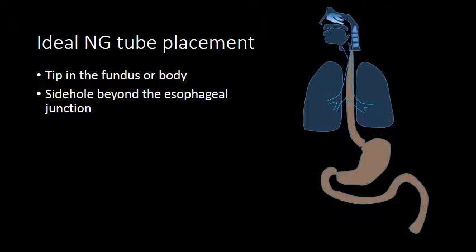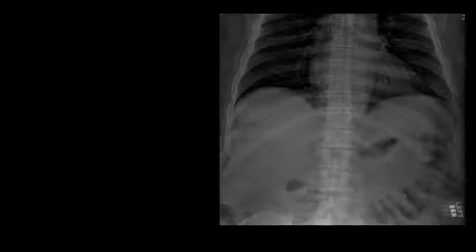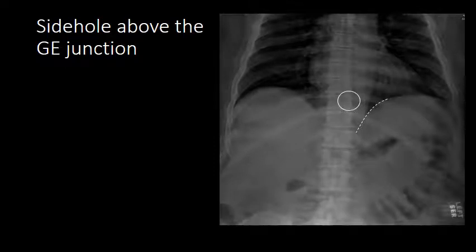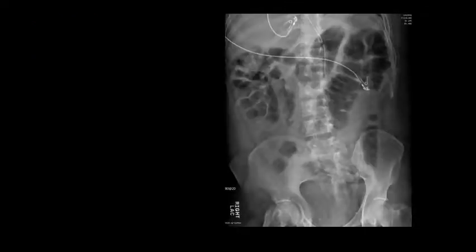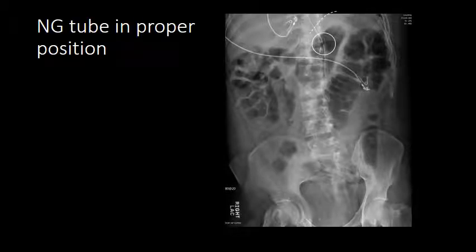When you think about nasogastric tubes as opposed to feeding tubes, one important detail is the side hole of the nasogastric tube. The side hole can be delineated on a plain radiograph as a break in the bright white line of the catheter, and this side hole needs to be below the gastroesophageal junction for proper function. Here is a commonly seen example of a suboptimally positioned nasogastric tube — the break in the white line is above the diaphragm. This catheter needs to be advanced approximately five centimeters for the side hole to go below the gastroesophageal junction. In another example, the break in the white line is within the fundus of the stomach below the diaphragm — this is a nasogastric tube in ideal position.